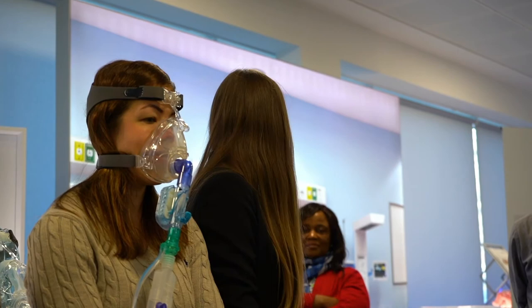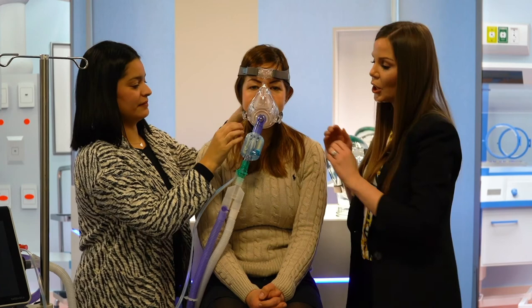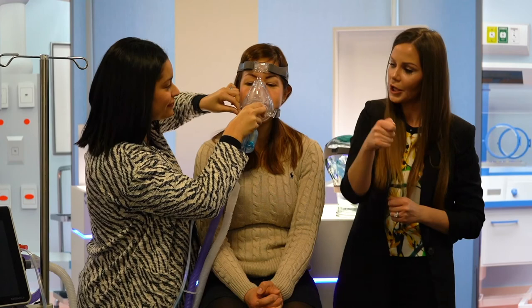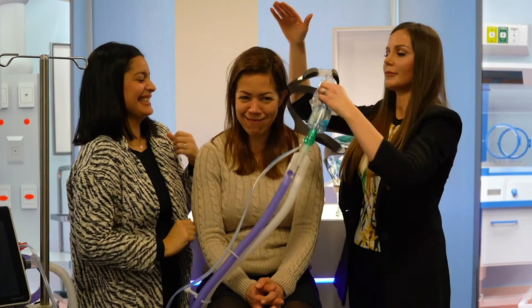After that, the patient's there for a few hours, the patient goes to sleep. The patient wants to have a drink of water. What would we do? Unclip from this part here, which is a quick, easy release rather than doing the Velcro way. So it's like a push-out action. There we go. And we could lift that off. We could do the other side if we wanted to. And I think we will because it's getting steamy there, isn't it? We give the patient a drink of water.